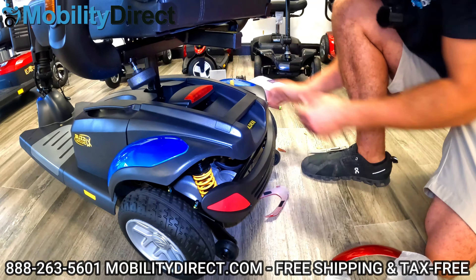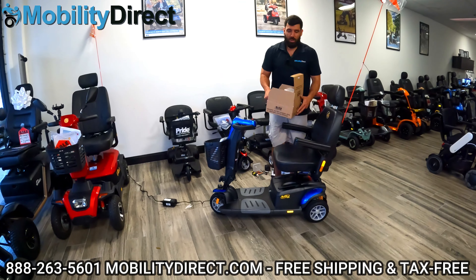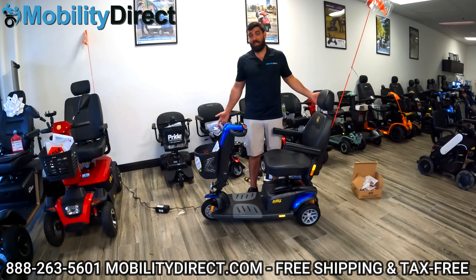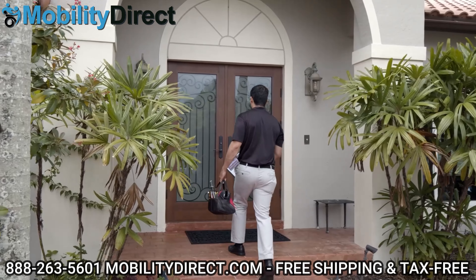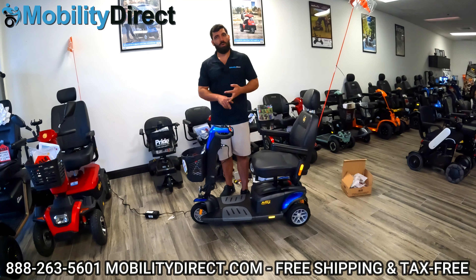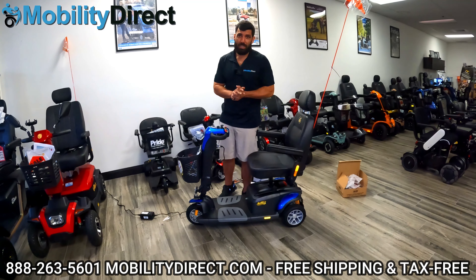That's pretty much done with the whole tutorial — pretty straightforward. Golden Technologies makes products that are built to be really easy to use, which is one of the reasons we love recommending them. Not only that, they're one of the only manufacturers that includes a one-year limited warranty on the battery, two years on the electronics and drive frame, and a lifetime limited warranty on the frame. They also include a one-year repair contract — if something goes wrong and it's covered by warranty, a technician will be dispatched to your home. That's a huge peace of mind. My name is Sergio with Mobility Direct. If you have any questions, leave them in the comment section below — we'll reply — or call our friendly non-commissioned sales experts.